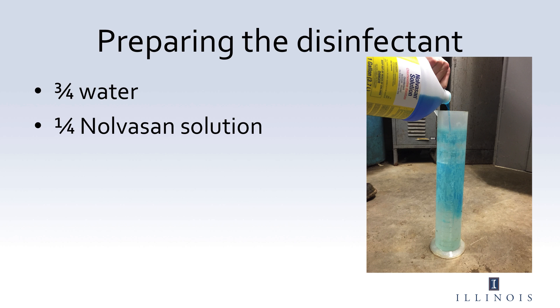To prepare the disinfectant solution, fill the cylinder three-quarters of the way full with water, and then fill the cylinder one-quarter full of Novosan solution. Place the MetroTech device into the solution and stir.